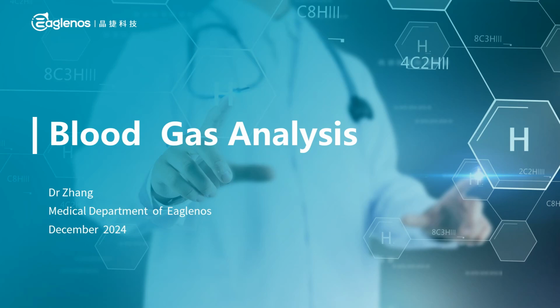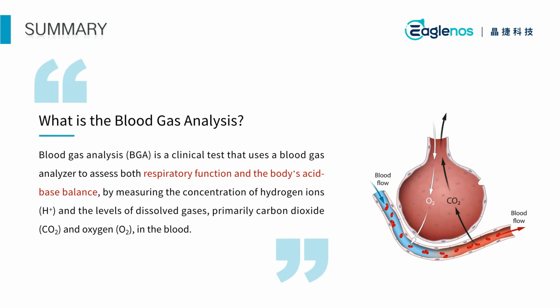Today, we will dive into the basic principles of blood gas analysis, explore the most commonly measured parameters, and examine how these values are applied in clinical settings. My goal is that by the end of today's session, you'll have a better understanding of the role and value of blood gas analysis across different clinical scenarios, which will hopefully improve our ability to assess and manage patient conditions more effectively. Before we dive into the specific applications of blood gas analysis, let's first take a closer look at what blood gas analysis is and what it entails.